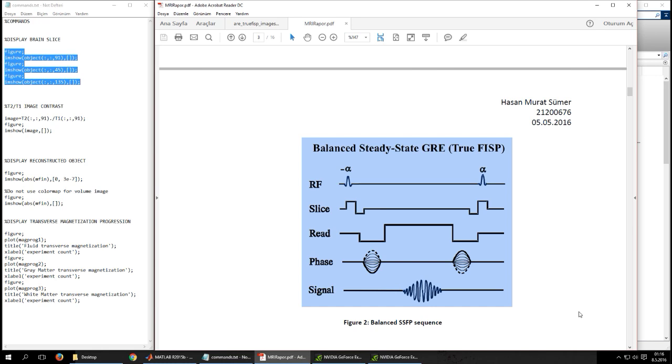For example, if the flip angle of our RF pulse is plus minus 60 degrees, first we apply a 30-degree pulse in X direction, so the initial magnetization is tilted 30 degrees to the Y-axis. With this case, when we apply minus 60-degree pulse, the magnetization will be tilted 30 degrees in minus Y-axis. So in two states, despite having opposite phases, the magnitudes of transverse and longitudinal magnetizations will be the same. In reality, however, in the time between two RF pulses, the relaxation effects will tilt the magnetization towards Z-axis.